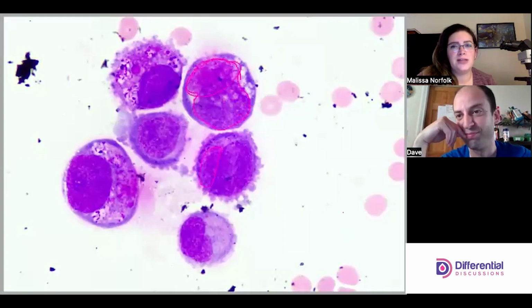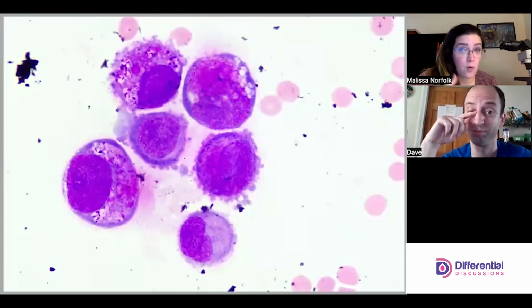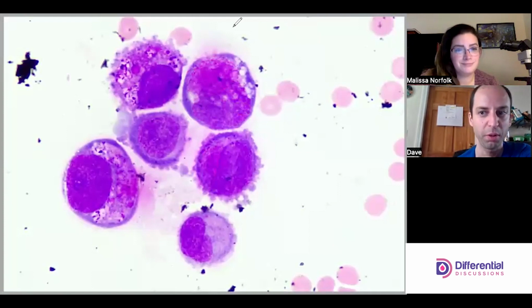It's almost like you can't tell if that's nucleus or if it's cytoplasm, especially if you've never looked at these large, ugly looking cells before. It can be really challenging to know, am I looking at primary granules like in a giant ugly myelocyte, or am I looking at part of the nucleus? And so you can't tell if you're looking at nucleus or cytoplasm. And I always see this in laboratories where a tech is not confident or comfortable with what they're seeing, and they make more slides in desperation to get it to look different.